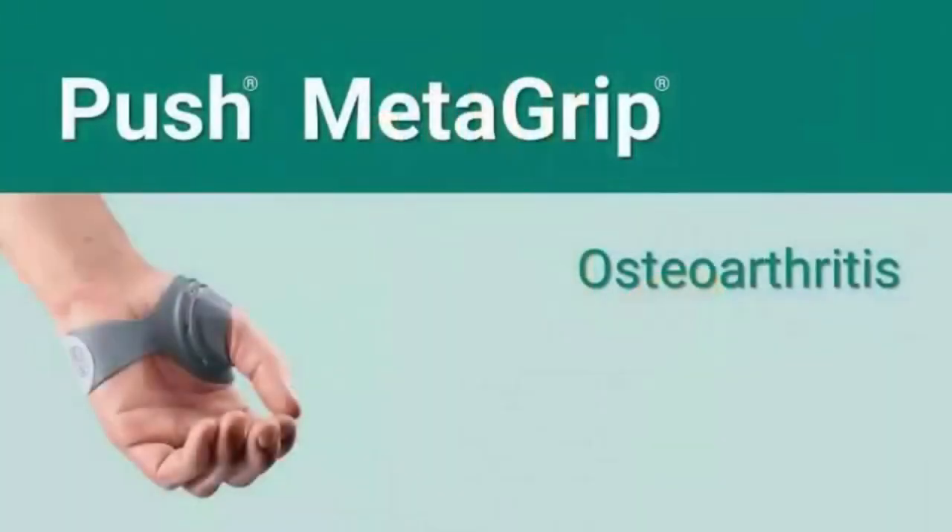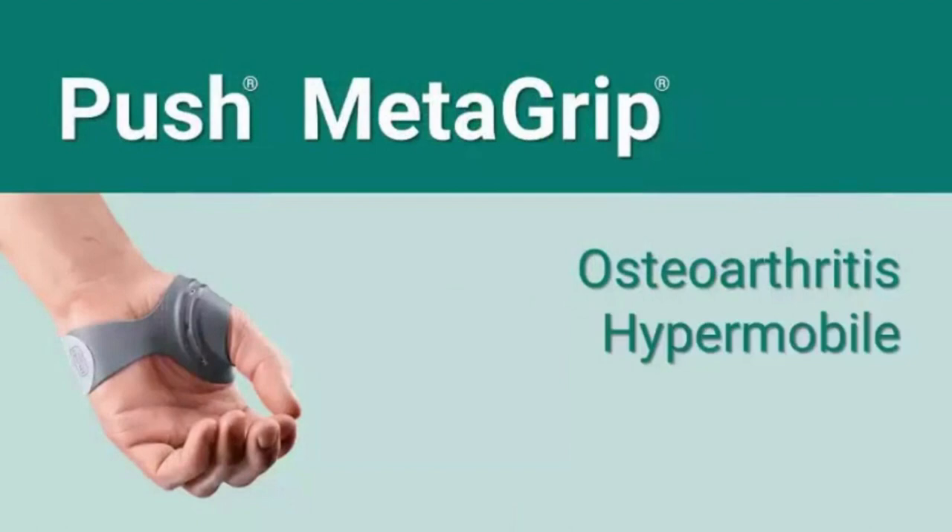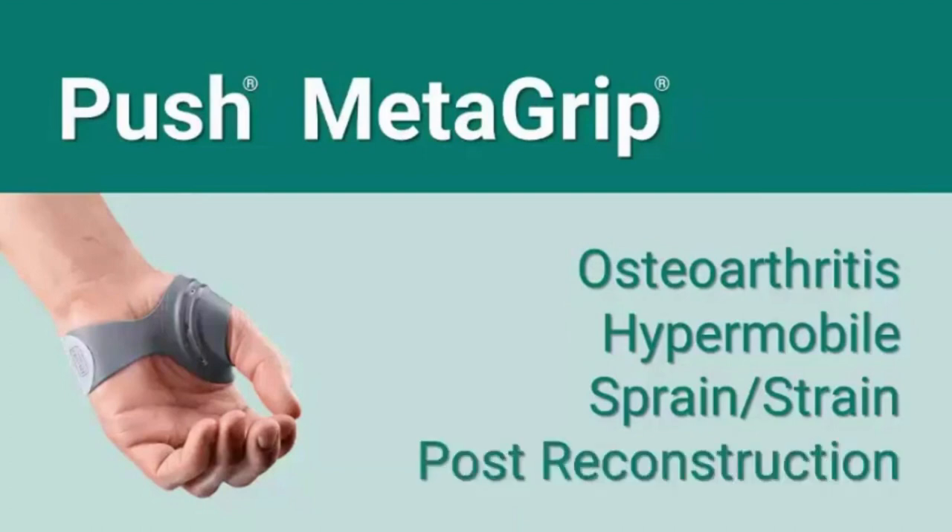The metagrip thumb brace is designed for individuals with thumb CMC osteoarthritis symptoms. Those with hypermobile CMC joints, a sprained or strained thumb CMC joint, or those who have undergone surgical reconstruction of the thumb CMC joint are also appropriate candidates.